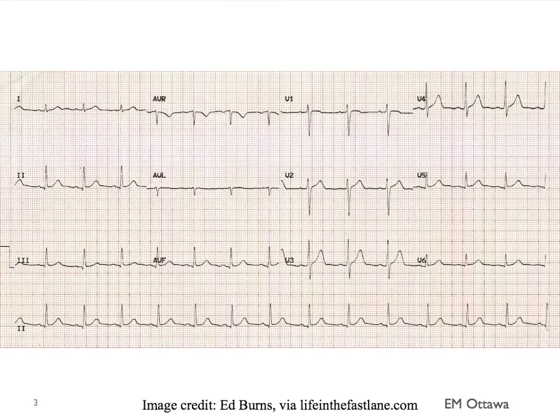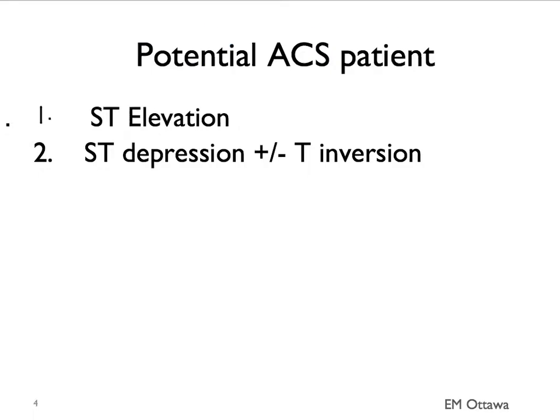This is a normal 12-lead ECG. When we're approaching a 12-lead ECG, we often start with rate, rhythm, axis, and so on. Once we make sure those are okay, we're going to move on to more specific details. These specific details include ST elevation and ST depression with or without T-wave inversion.